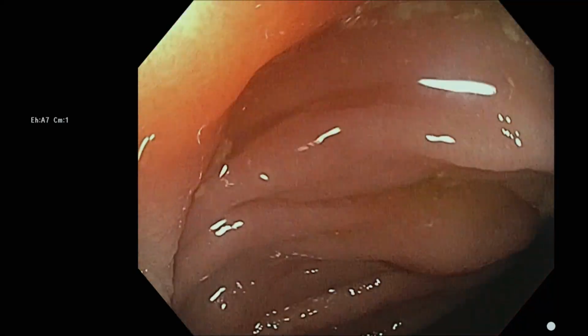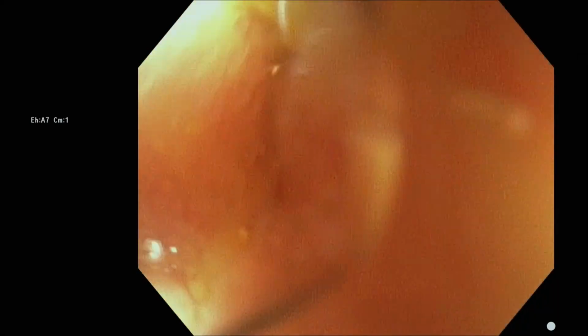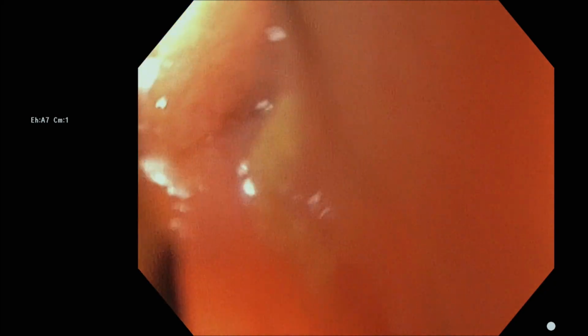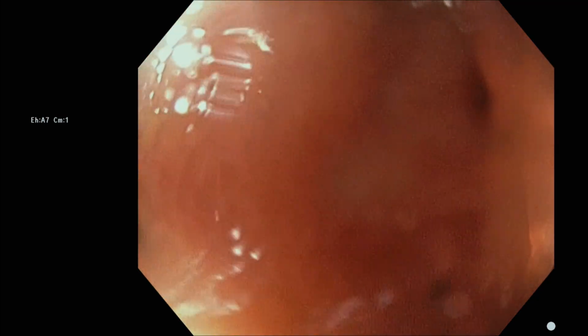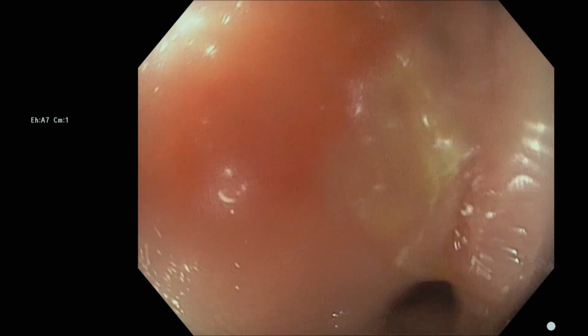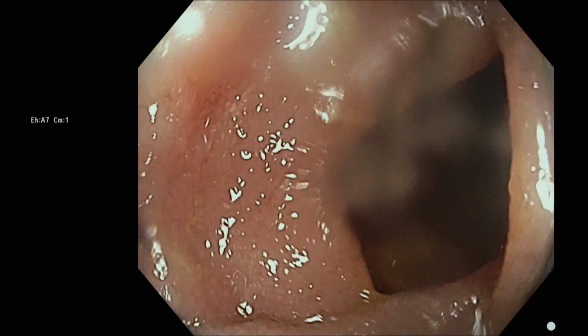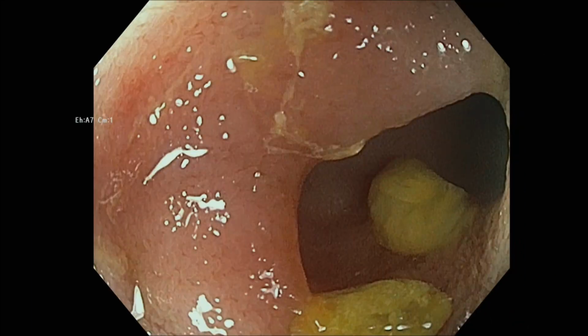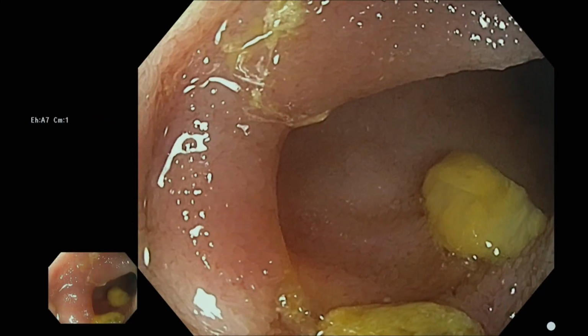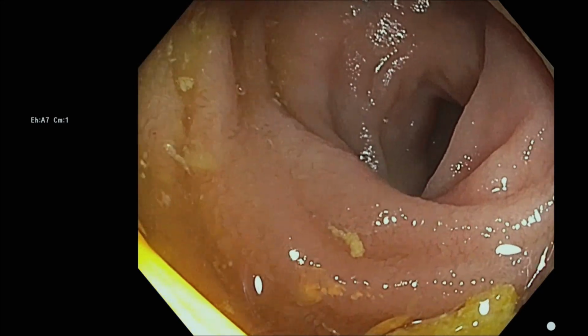So this is what I mean by the direct approach. You just deflate a little bit, visualize the lips of the valve, and then drive the scope tip up there and wedge the scope by deflection between the lips until you pop in. And if you have nothing on the end of the scope, you can do this even with an adult scope, and almost everybody who's basically undergoing normal surveillance, screening, diagnostic examinations. Occasionally a little bit of abdominal pressure, especially in the right lower quadrant, can help.